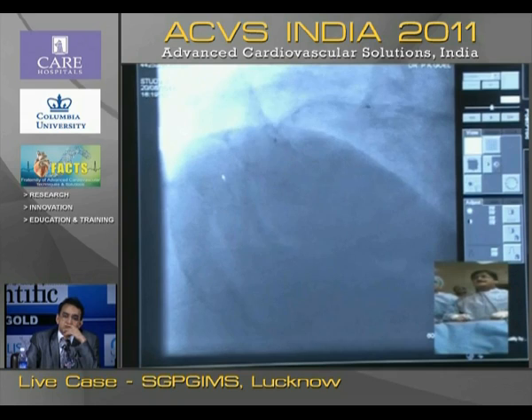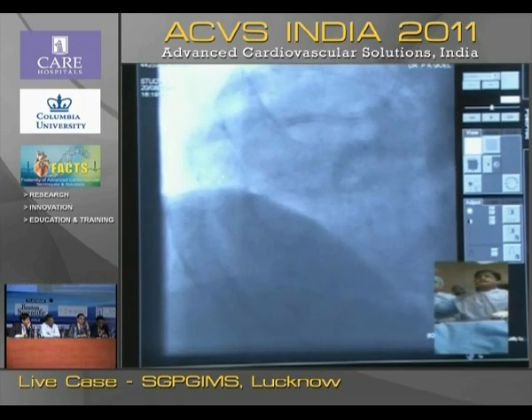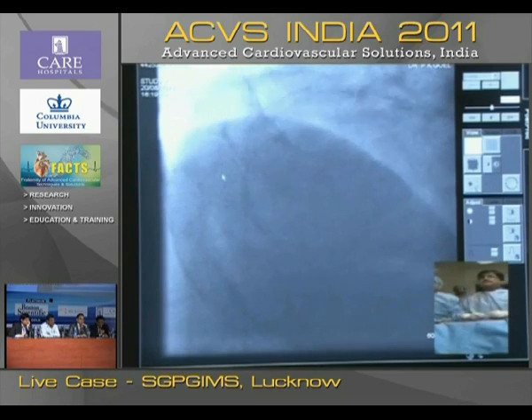It will suck. It will suck. Deep throating all the time. It will suck. Yeah, that's part of the game. You chose a catheter that is meant for deep throating.